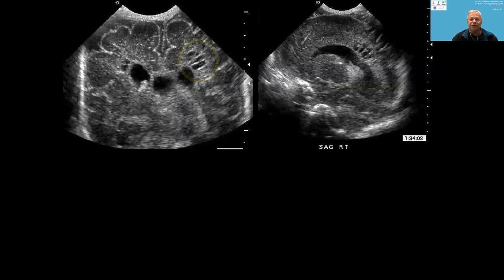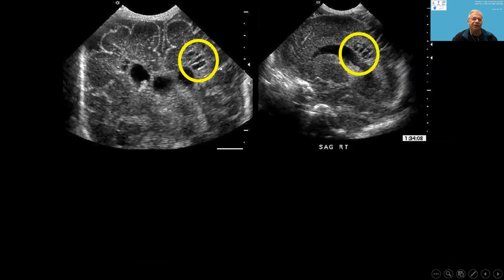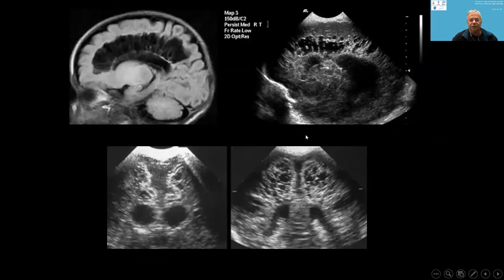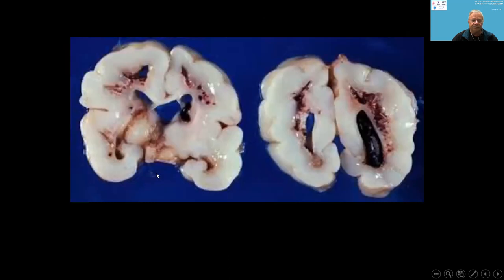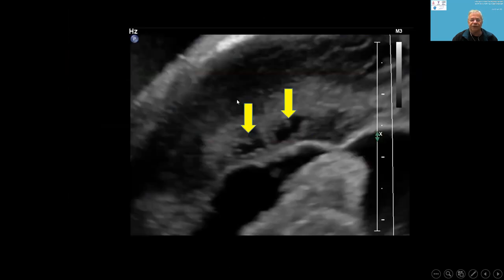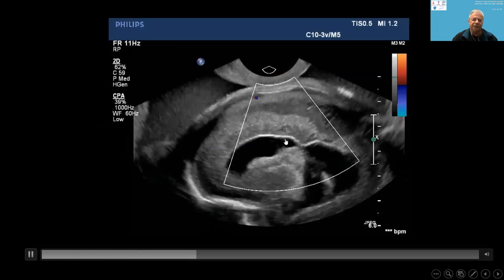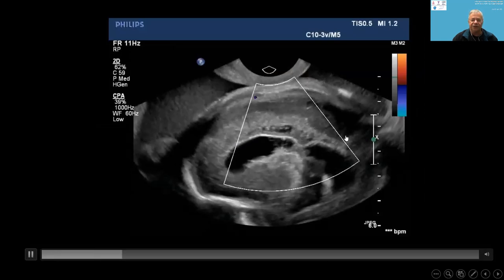Here are some examples in sagittal and coronal views in the neonate, and histology of this condition. On ultrasound in utero, this is the ventricle, shown in the third trimester.